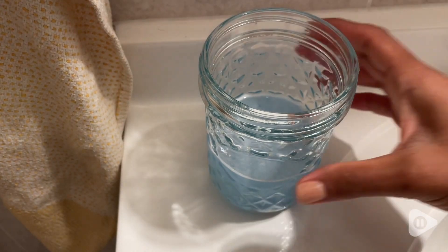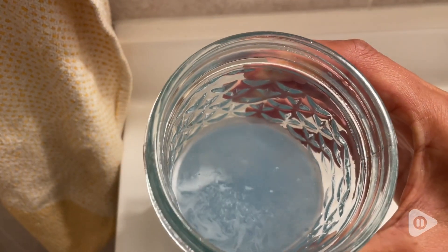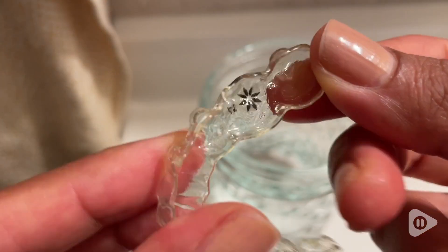Hey there, this is Alisa with WTI. I'm always looking for ways to keep my Invisalign clean, and I have found these retainer cleaners by M3 Naturals that I have been loving. First of all, they're super easy to use.